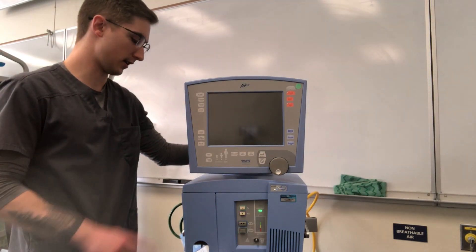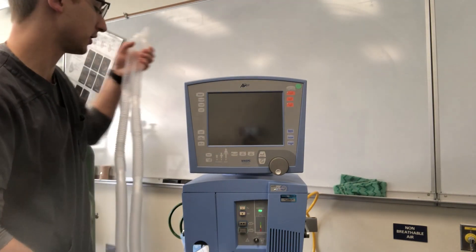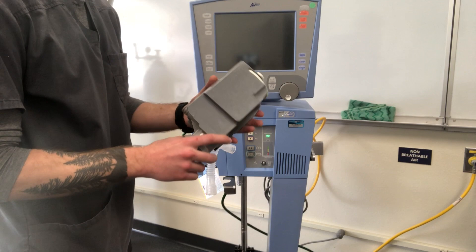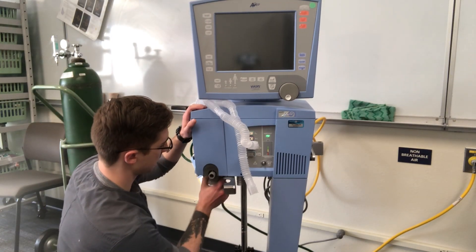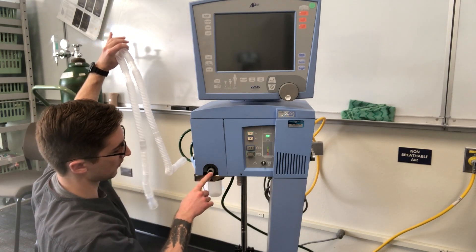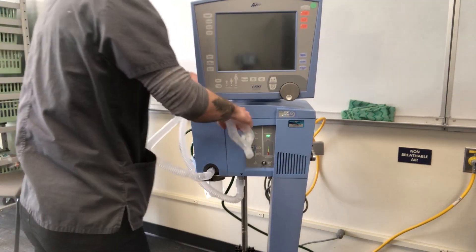The Avea ventilator uses a basic Y circuit, so any basic Y circuit can be used with humidification or with just a plain HME. It uses an expiratory filter, which is reusable — there are also disposable models. The filter slides in firmly and a water trap is below. The inspiratory side is here and the expiratory side is towards the expiratory filter.